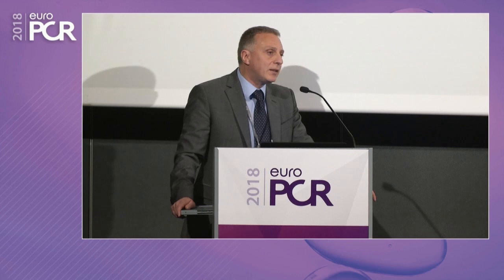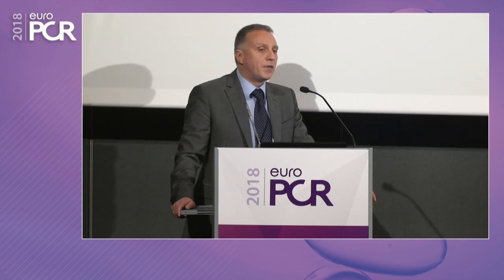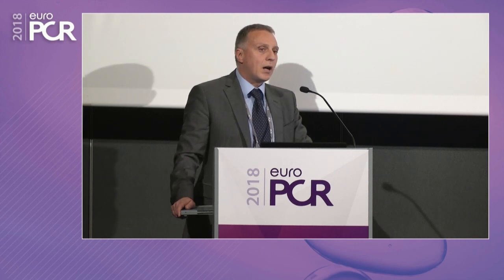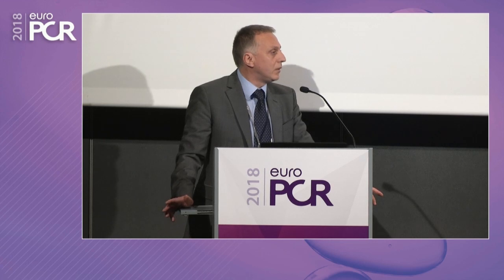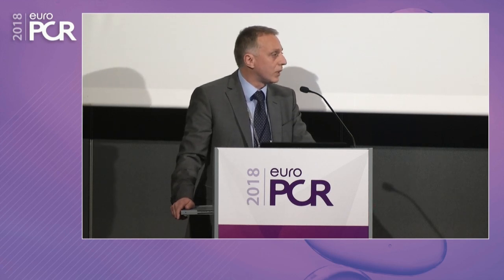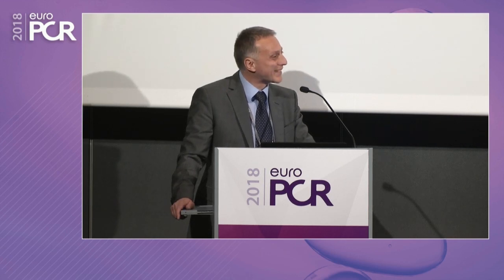I think that in the setting of left main, the fact that, as you mentioned during your introduction, we are most often facing 90 degrees, 80 degrees angulation, facilitates the performance of this technique, while it may hinder the practice of the DK crush a little bit. But I mean, we have the DK crush operators in China, which are fantastic. They're able to do it with any kind of angulation.